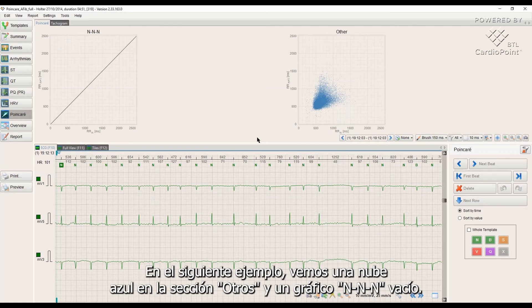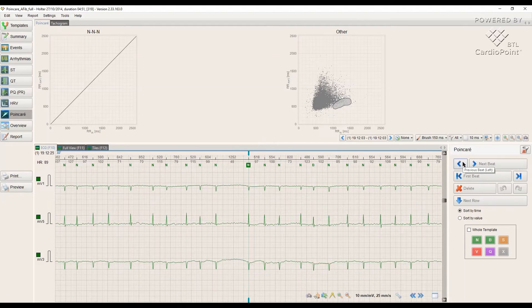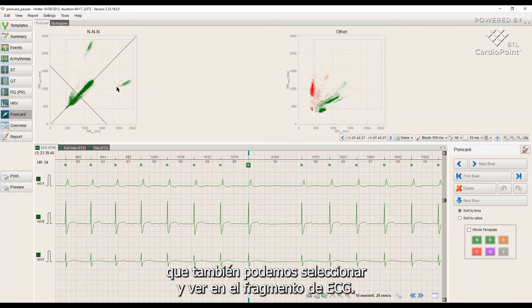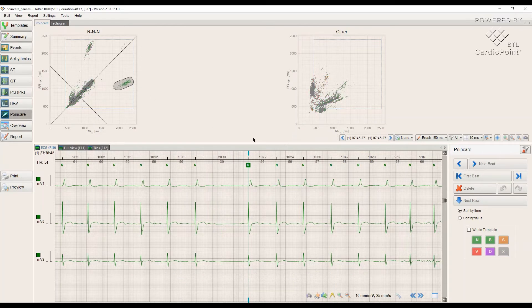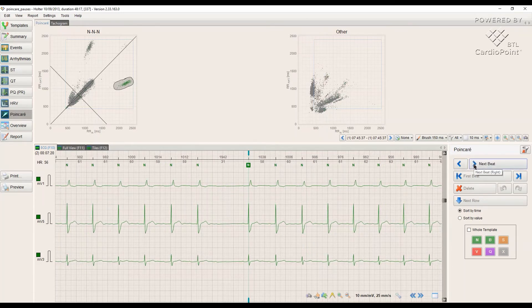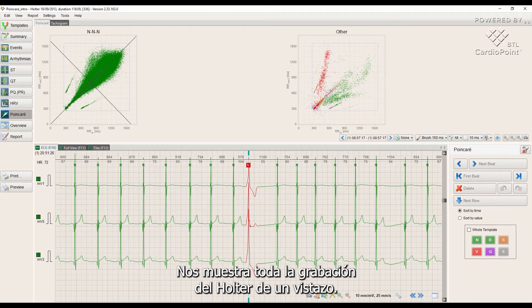In the following example, we see a blue cloud in the 'Other' section and an empty NNN graph, which tells us about a persistent atrial fibrillation throughout the signal. Finally, in the third example, we find the presence of pauses in the signal, which we can also select and view on the ECG fragment. Poincare is an instant analysis of heart rate variability — it shows us the whole Holter recording at a glance.